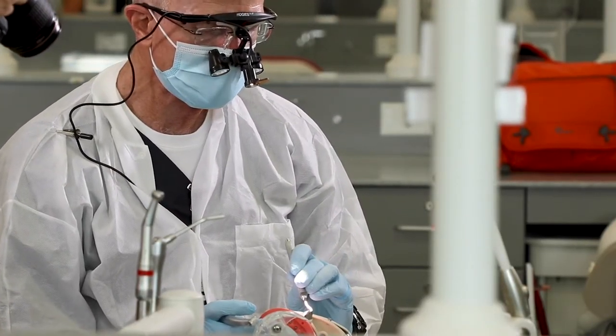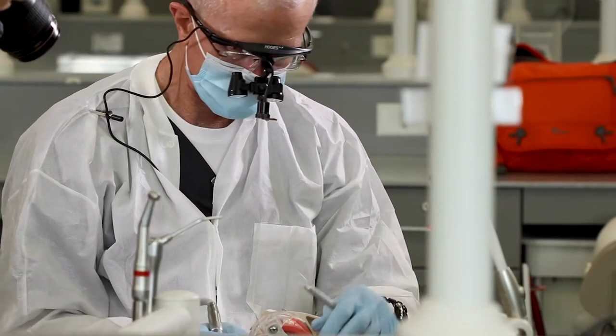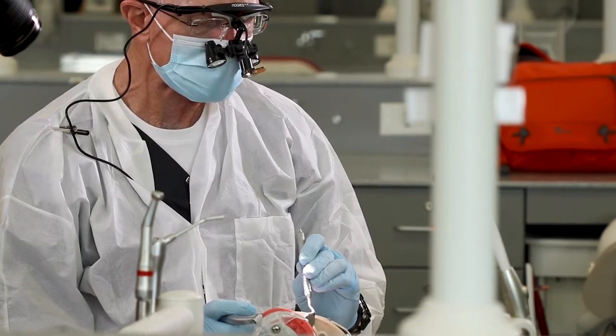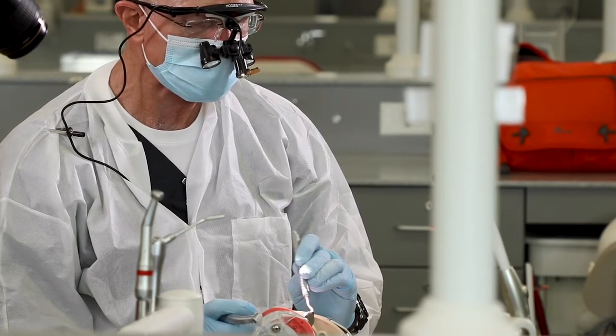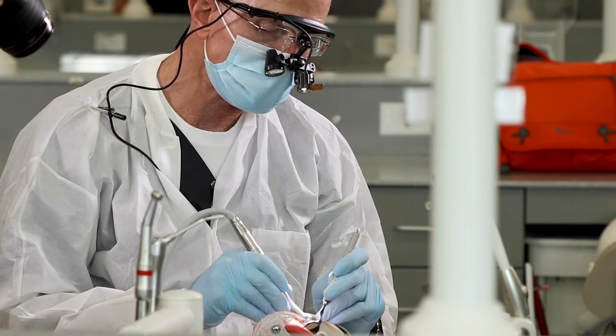This is a time where you'd have your patient open and close quite a number of times to help you nicely mirror the opposing occlusion. We're going to take a little bit more still and move that ridge a little bit to the mesial. We're probably slightly over-reduced on the distal — that's just fine. We're about right now on the mesial; I could try to get a ridge a little more to the mesial, so we'll do that.